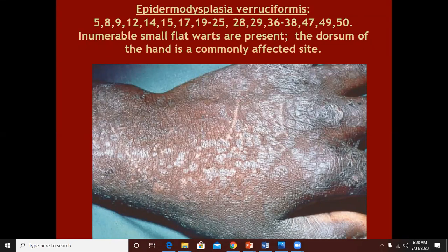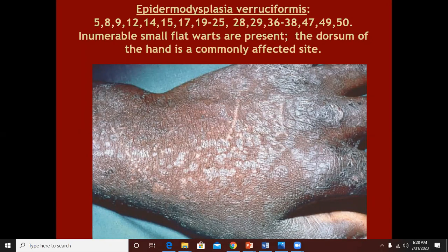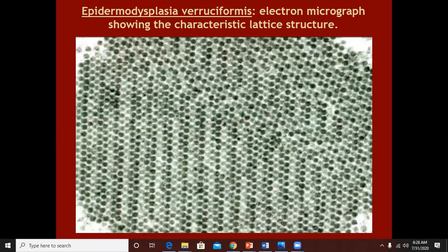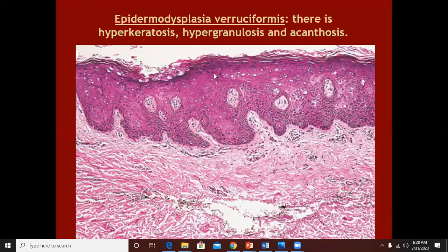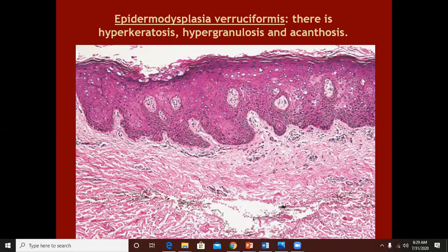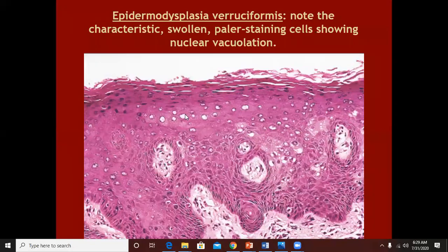Epidermodysplasia verruciformis (EDV) is caused by a different kind of human papillomavirus and is characterized by innumerable soft flat warts that can occur everywhere, including the face and chest. Since EDV has the appearance of plain warts, histologically it would also be like plain warts — there will be hyperkeratosis, hypergranulosis, acanthosis, and vacuolated keratinocytes in the upper layer of stratum spinosum or in stratum granulosum. These are the vacuolated or pale-staining koilocytes.